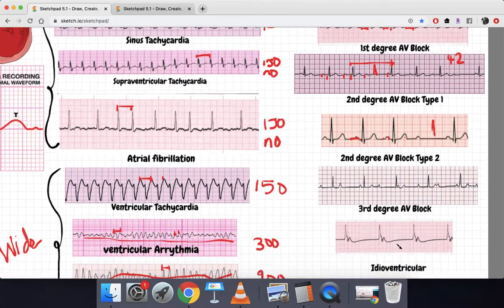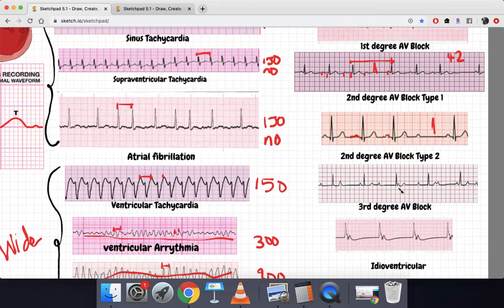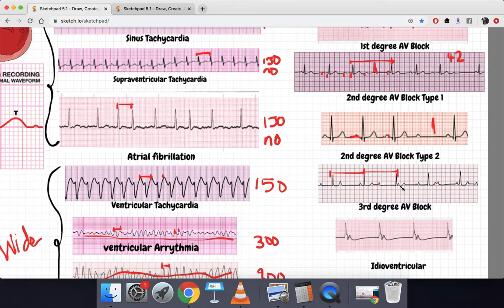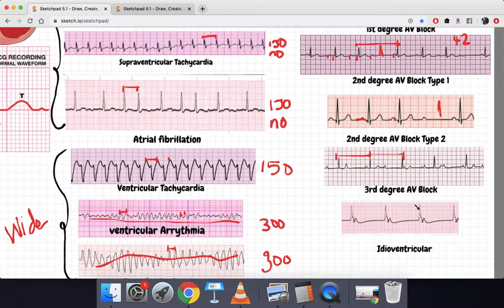Type 3 is a very complex one and it's difficult to explain, but I'll try my best. The R intervals are definitely prolonged — so this is a bradycardic arrhythmia — but the R intervals are equal. There are P waves: this is a P wave, this is a P wave. You may be tempted to think this is a T wave, but these are all P waves. The P waves are not where they're supposed to be — for example, this one joins with the T wave making an M shape, and this one is even before the T wave. There's no prolongation in the PR segment and the R intervals are equal. This is what we call a third degree AV block.